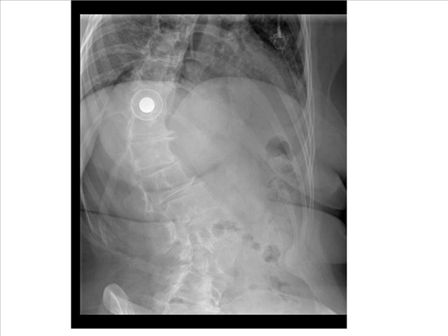Collimation improves radiographic contrast. Shield gonads. Suspend respiration on inspiration for above the diaphragm and expiration for below the diaphragm.